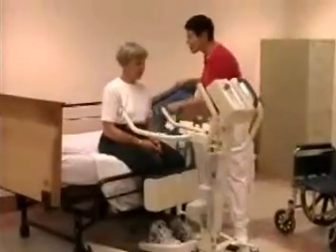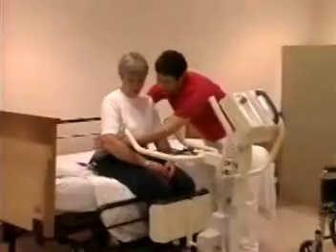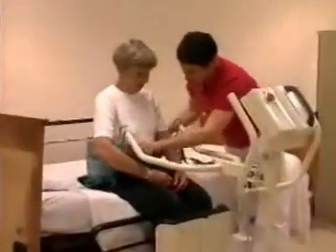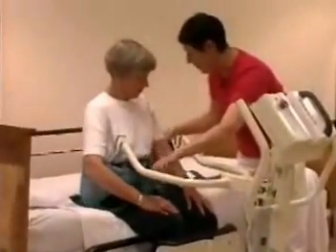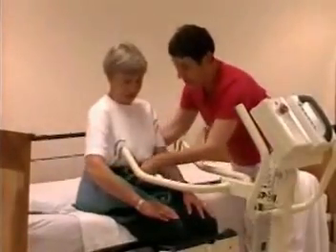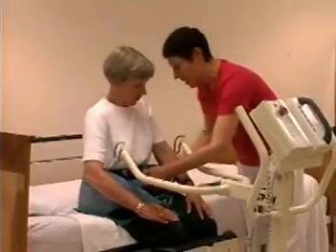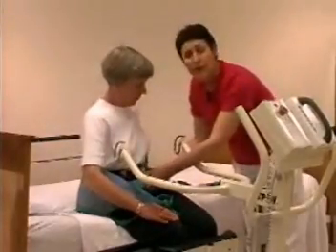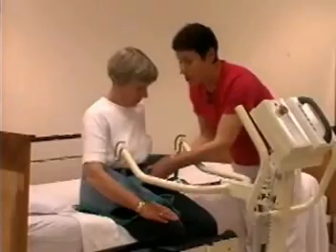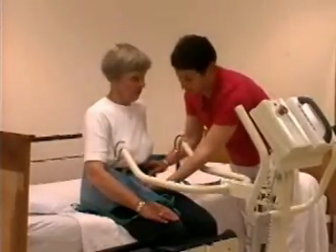And then we're going to place this sling around you. The sling has a safety strap. When you're securing the strap, you don't want it to be too tight, just comfortable.